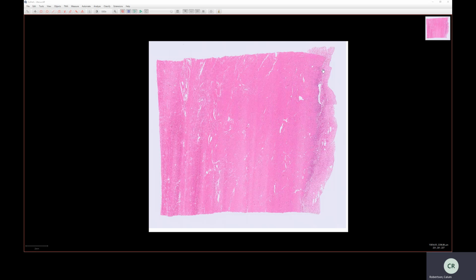So the endometrium in this example is actually not entirely normal. It looks like this patient has had some sort of progesterone therapy of one kind or another, so we'll not get lost among the detail of that too much. But this is the endometrial cavity on this side. This is the endometrium, which has two layers.